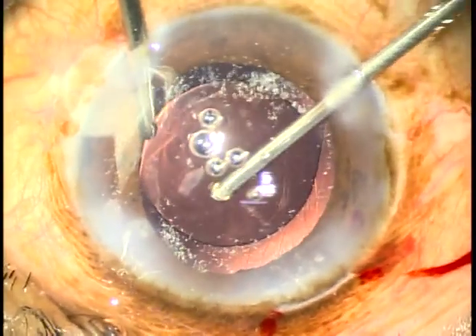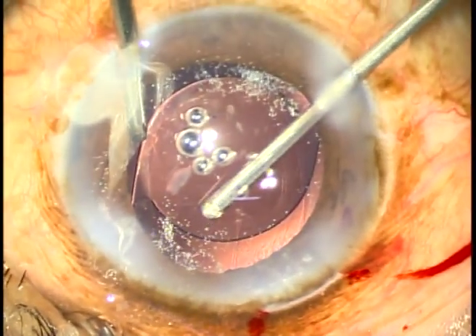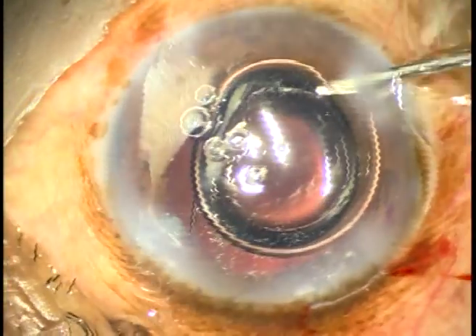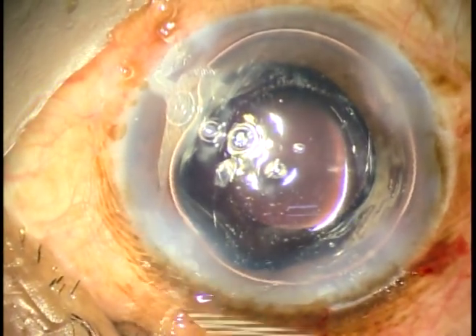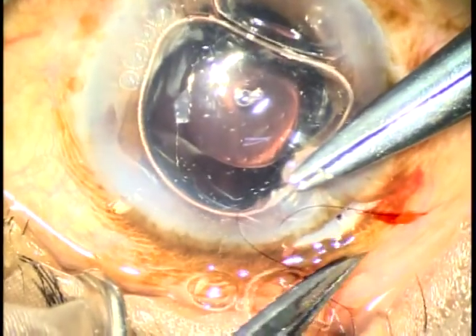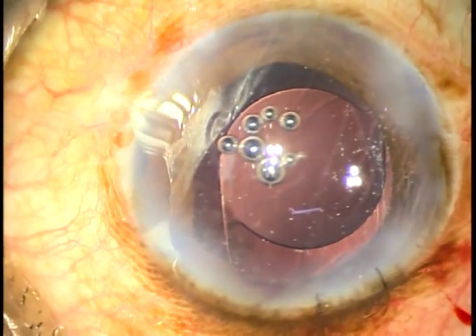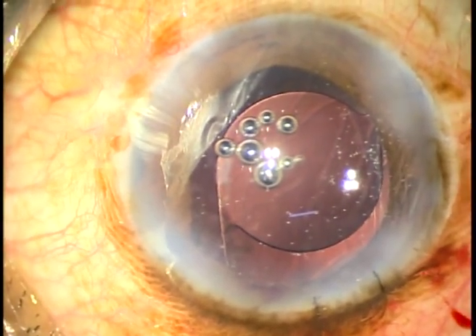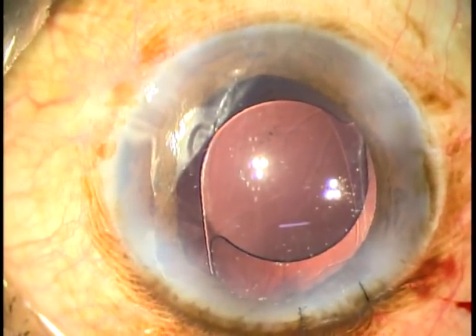You can see that the bag is being nicely supported by the lens. Now I put two interrupted sutures to close the enlarged incision — and it looks like this. This patient did very well, and at the end the surgery looked nice. This is the post-op picture: the eye is quiet on the first day post-op.